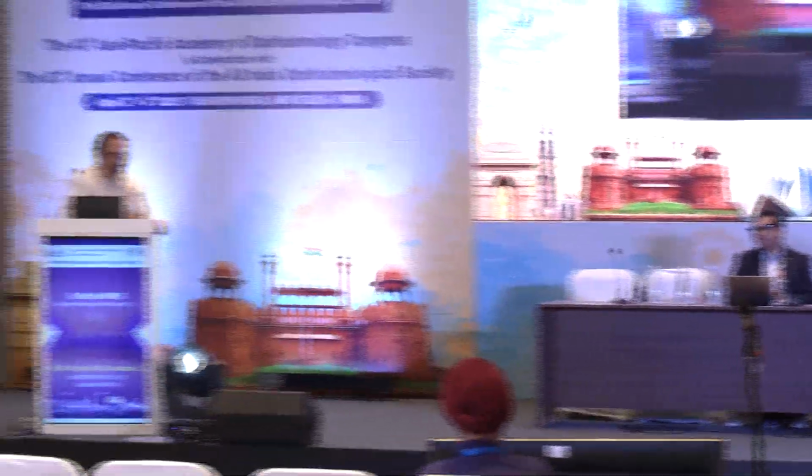See, mostly, sir, for the RK eyes, I generally prefer a zero asphericity. But for the LASIK treated eyes, I generally see what the quantum of correction the patient has received. If the patient has received a very large myopic correction, then generally these corneas are comparatively flatter and their Q value is changed. So in these patients, the patient may be happy with a zero asphericity lens, but if the patient has undergone a very minor correction, say up to about 3 or 4 diopters, even the normal regular minus asphericity lenses would do fine, like the Tecnis and the Alcon.